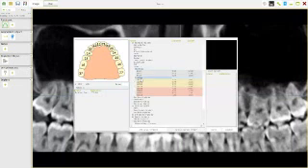If I go to the UZ range, we have 3.75s and 4.5s, and these are the different lengths in that range. Now, normally in the maxilla, I like starting off with something like a 15. But I think 15 is probably going to be a bit big in this case. So I'm going to go for 3.75 at 12.